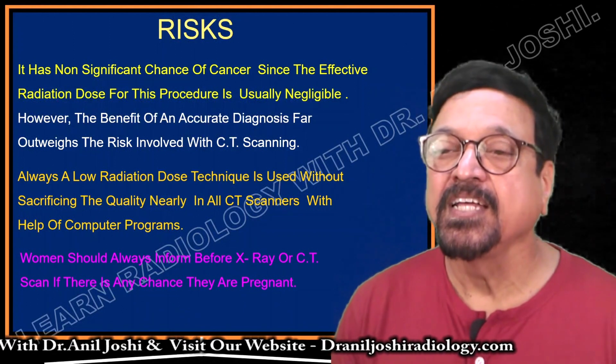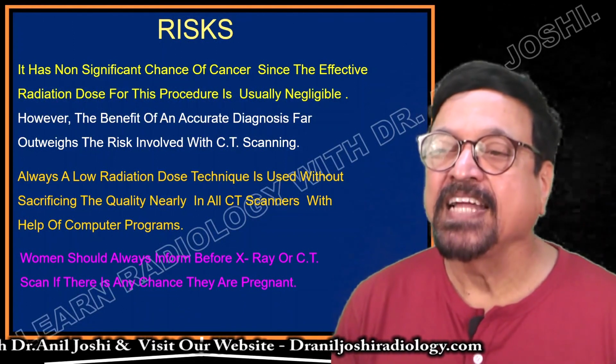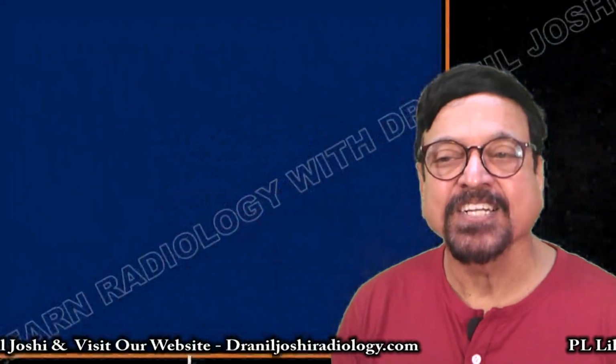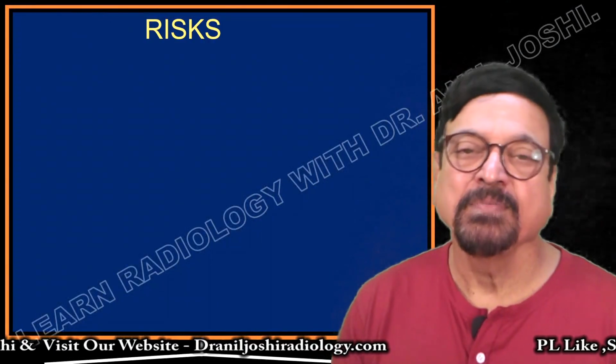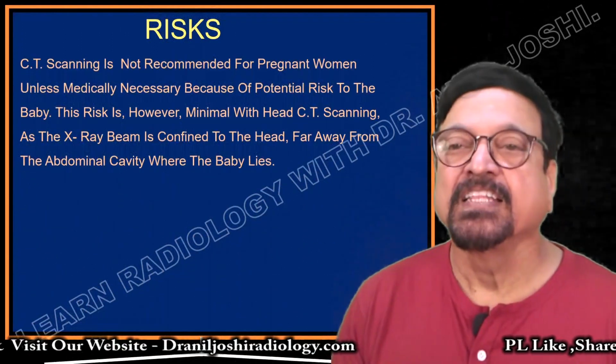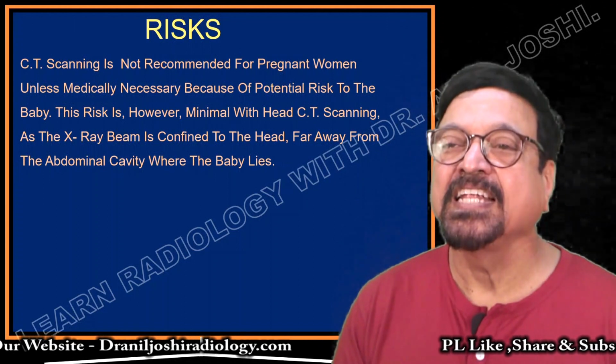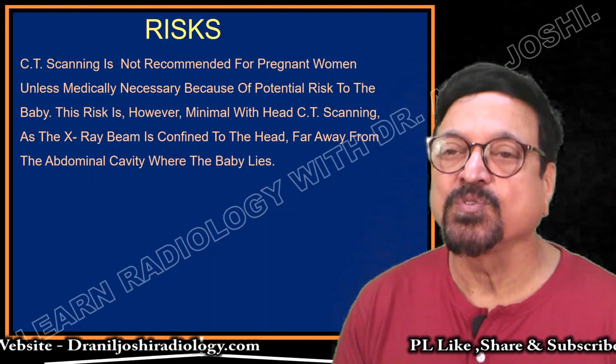Women should always inform before an X-ray or CT scan if there is any chance of pregnancy. It's a standard instruction and most of the time it is followed. Now CT scanning is not recommended for pregnant women unless medically necessary because of the potential risk to the baby.